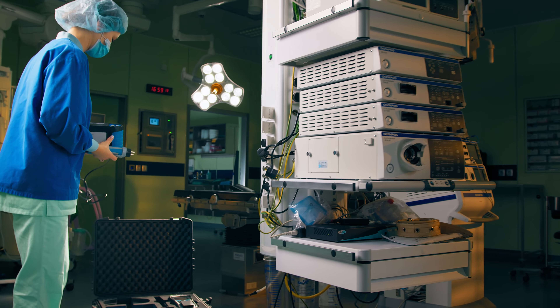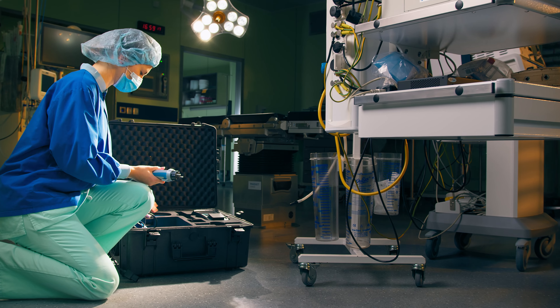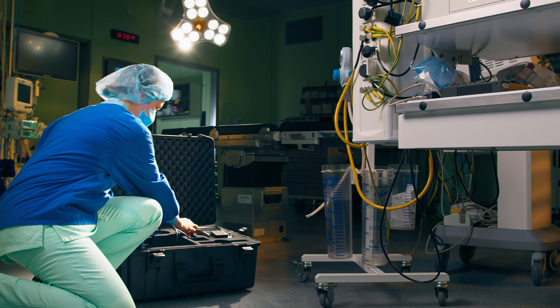Never forget — you are the first line of defense in preventing deadly failures of electrical safety.